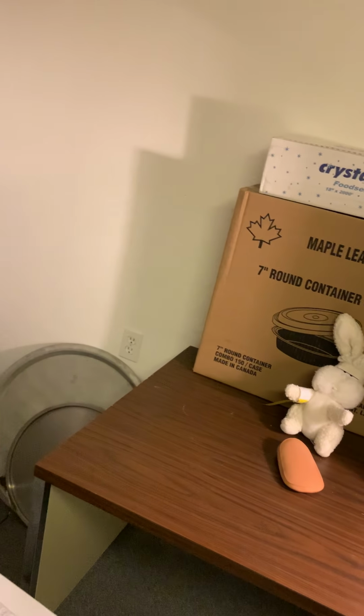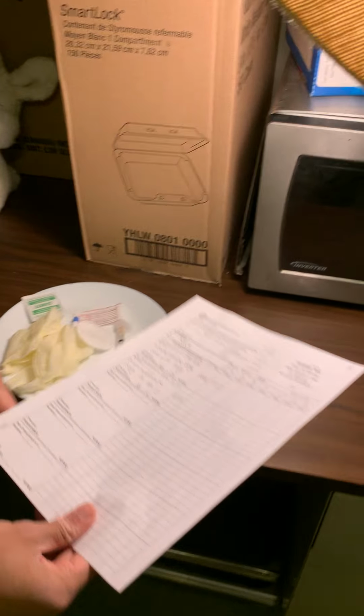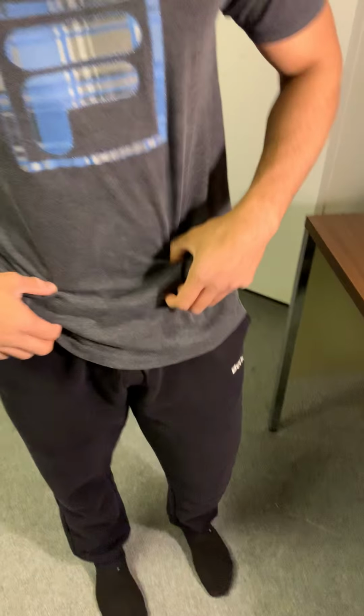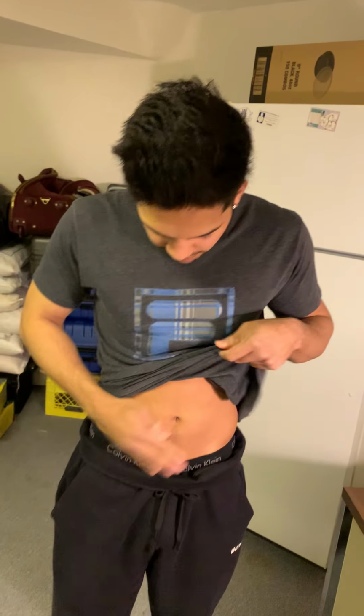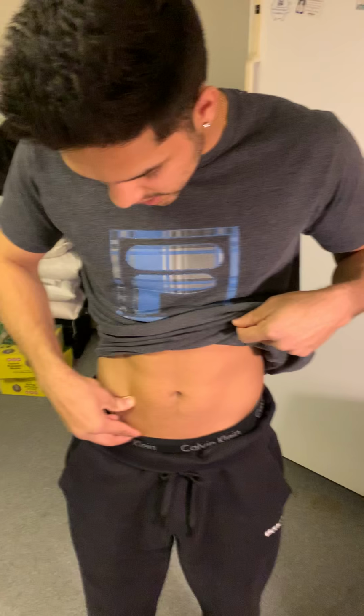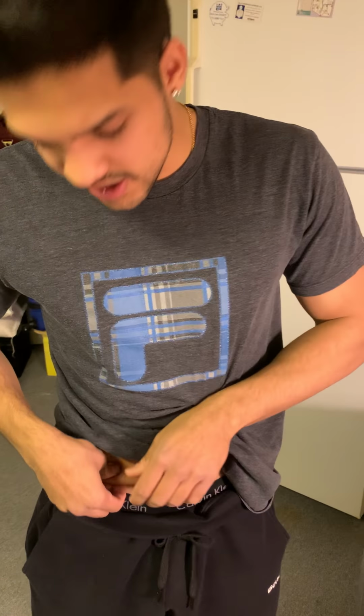Okay, now that I've done my patient education, I can just start landmarking where I'm going to be giving this medication. First, I'm just going to landmark on myself. I'm going to be going 5 centimeters away from the umbilicus, in this lower part of the abdomen, and I'm going to be gripping fat. I'm going to be bunching up the fat. I can bunch up to 2 inches of fat and give it a 90 degree angle, or whichever angle suits my patient's body weight and size.